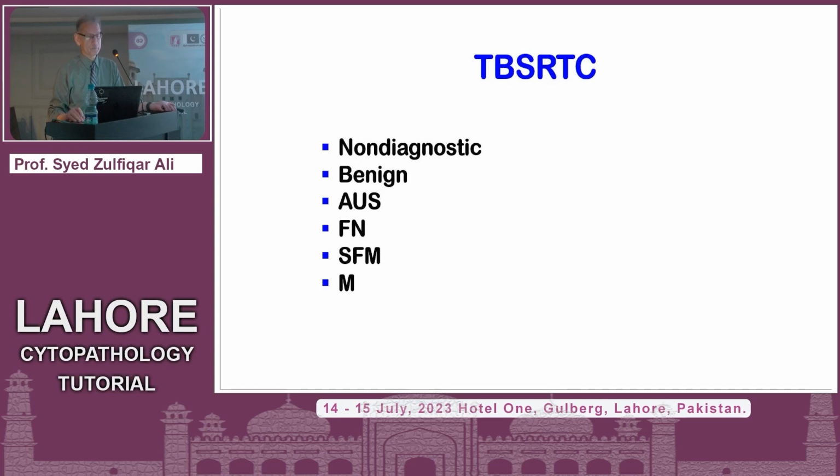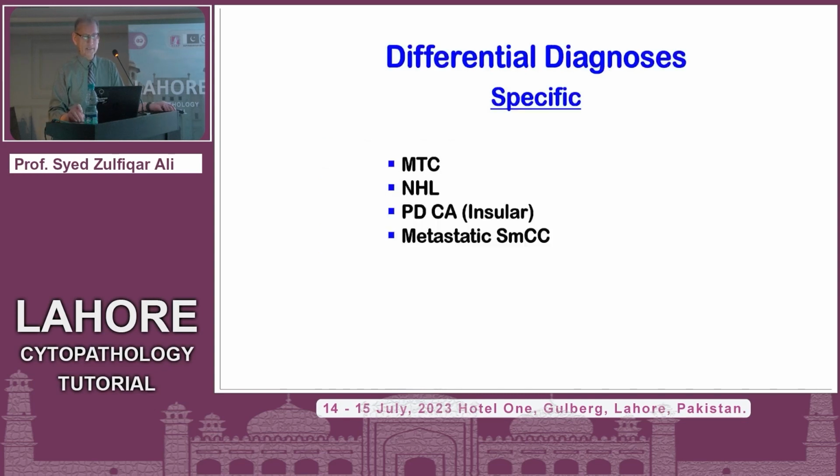AUS, follicular neoplasm, SFM, malignant. Absolutely, with those mitotic figures, how can you think benign? So now what is the diagnosis?